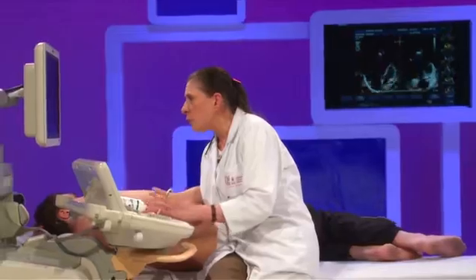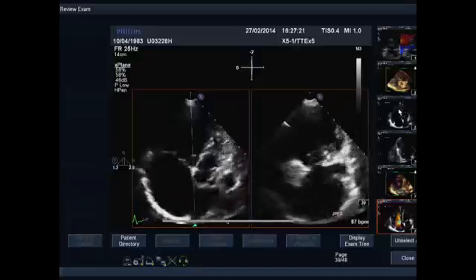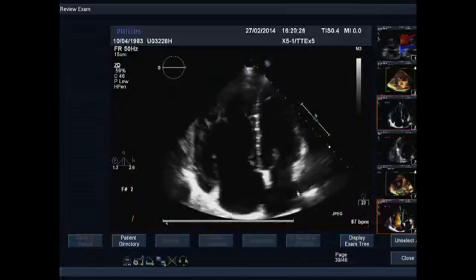One other point that you may have to consider is if you want to go for percutaneous closure. So it's important to make the measurement, and of course you will have precise measurement if you go for transesophageal or for 3D echo, and this is mandatory if you envisage a percutaneous procedure, but you can already have a good idea of whether it's feasible or not when you go to the four-chamber view, and I will freeze my screen here.